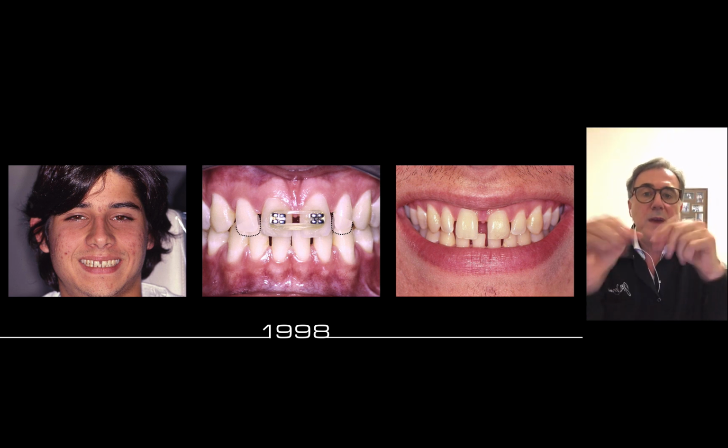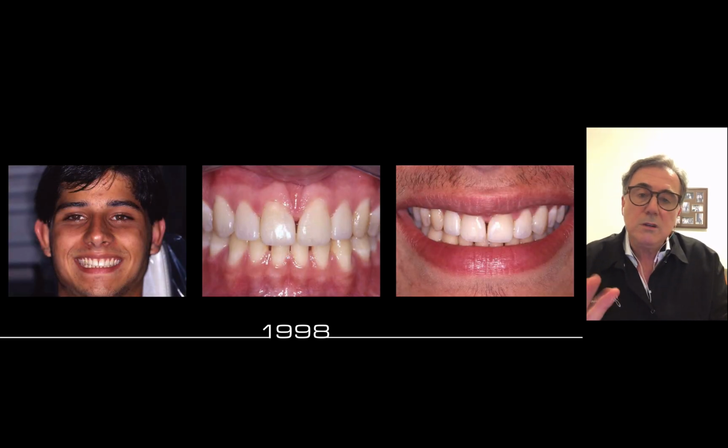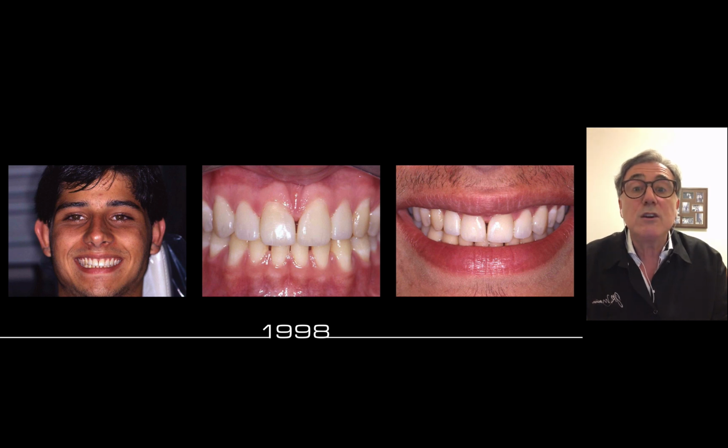After removing the rubber band and the bracket, we restored the two centrals. We used, at the time, Herculite XRV and Renamel. Herculite from Kerr and Renamel from Cosmodent. So that's the patient right after we did the restoration, and he disappeared for like 11 years.